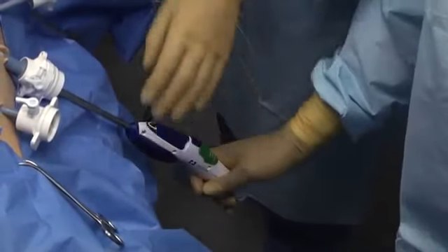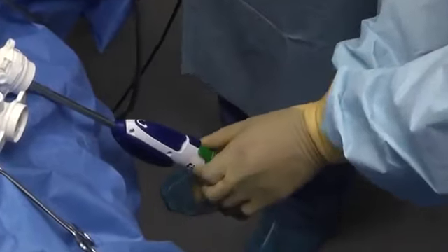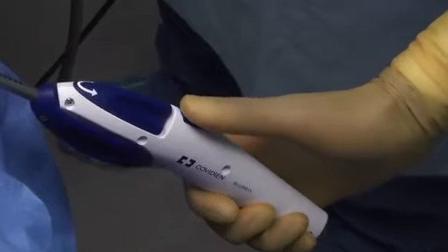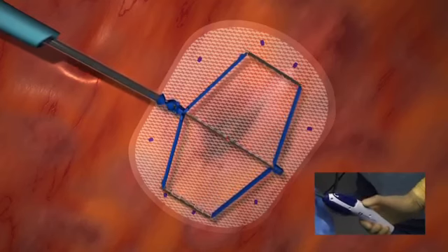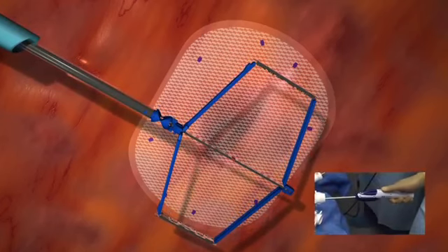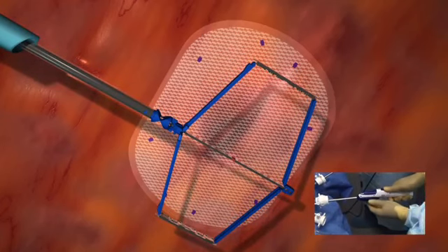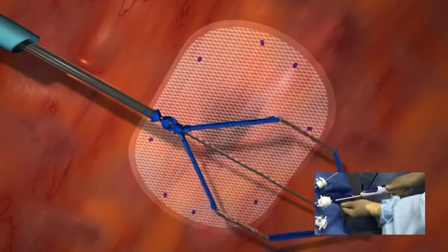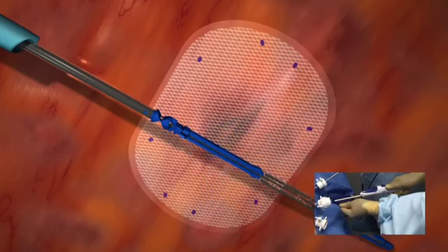Remove and discard the mesh detachment lock, then pull back the mesh detachment lever on the handle to release the small clips holding the mesh to the frame. Lower the device until it is fully separated from the mesh. The clips will retract automatically. Close the deployment frame by pushing the deployment lever away from the handle body until the deployment section is fully closed.